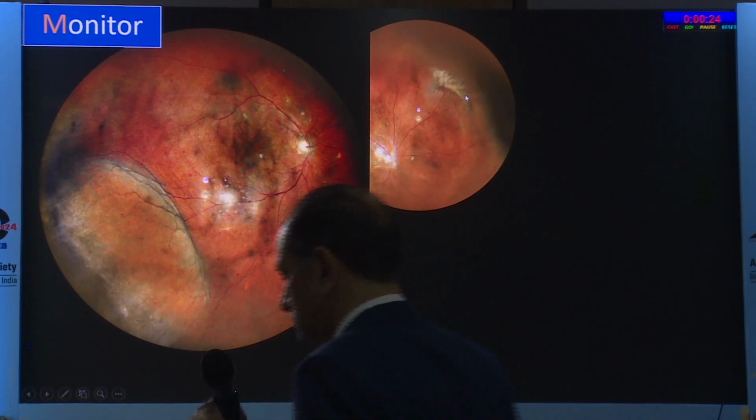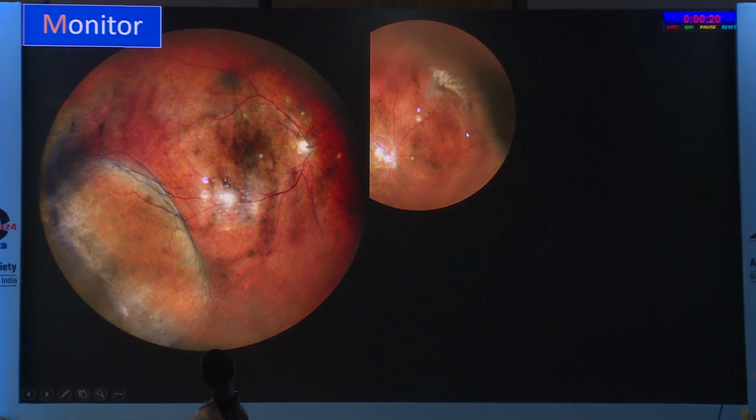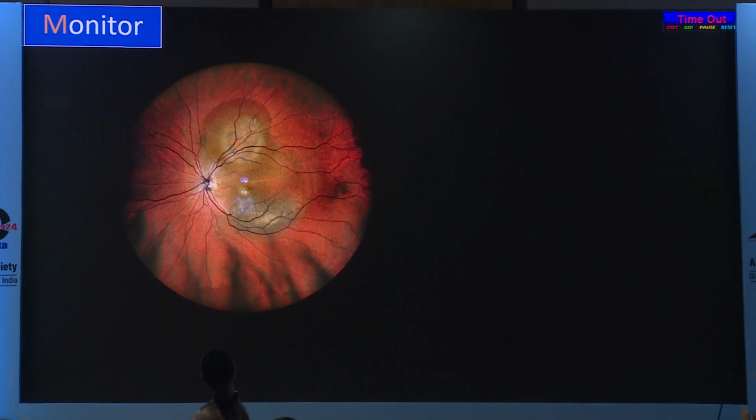subretinal fibrin with exudation. The patient had acute renal failure with fluid overload and exudation throughout the body. Had a puffy face and puffy legs along with similar effusion in the eye. All we had to do was closely observe this patient. As the symptoms of acute renal failure subsided, so did the choroidal detachment and the subretinal fluid. So it is extremely useful in monitoring cases and analyzing cases when you are at the crossroads and don't know what decision to make.